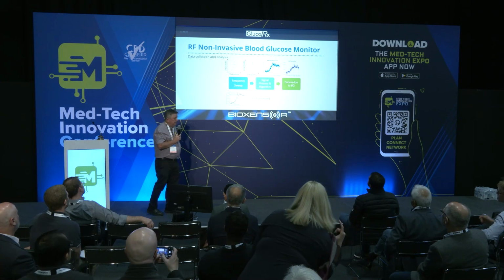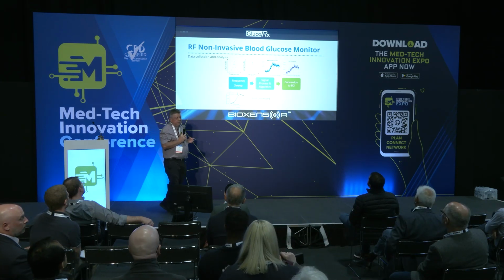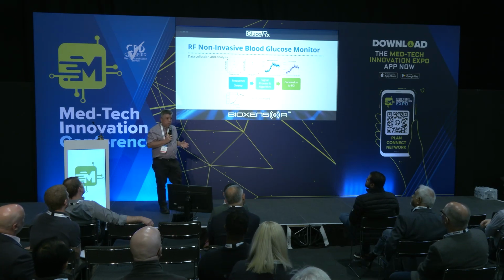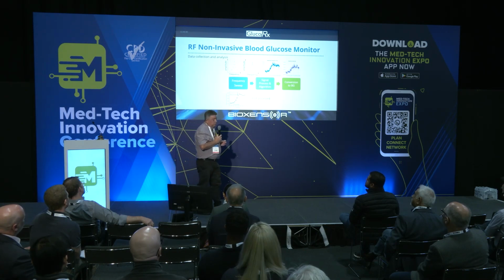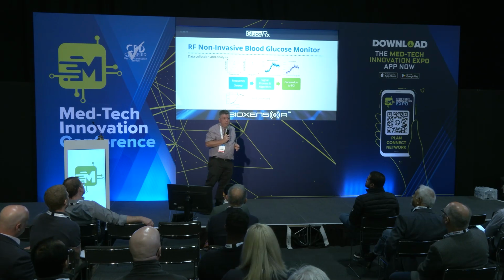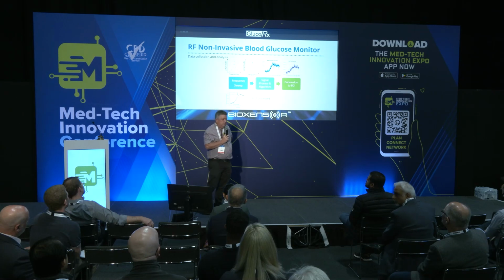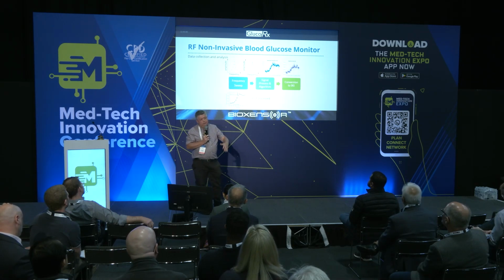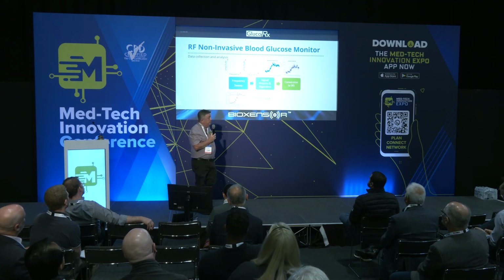I'll say something about that in a minute. And in those clinical studies, the subject is fitted with a cannula, so we have access to venous blood as and when we want it. So the subject goes through an oral glucose tolerance test, which some of you may know of, but that involves just drinking a solution of known concentration of glucose, and then subsequently your glucose level will go up and then come back down or stay there, depending on your condition.